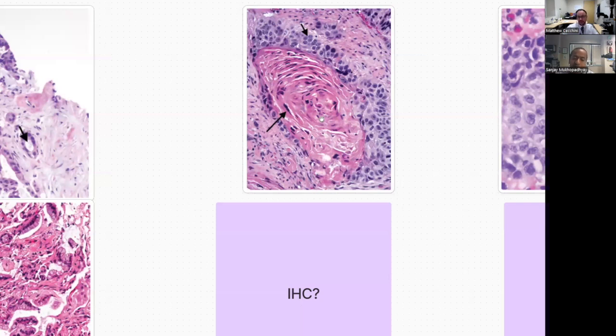High risk HPV, yeah, CISH, and there you really can tell, because lung is never positive for high risk HPV, at least in my experience. Never, and in the publications that I've seen. So there is a good rationale to do it there. Otherwise, there is no rationale here to do immunohistochemistry, for me at least.